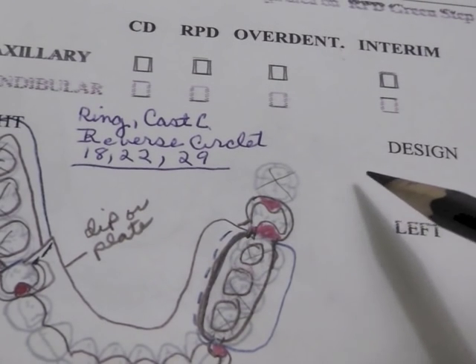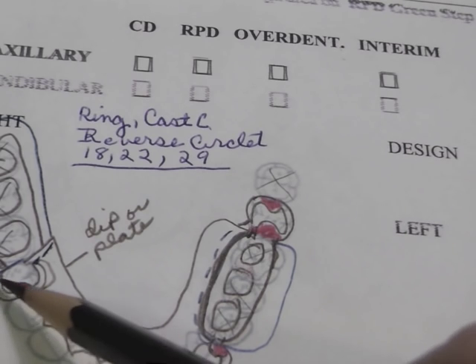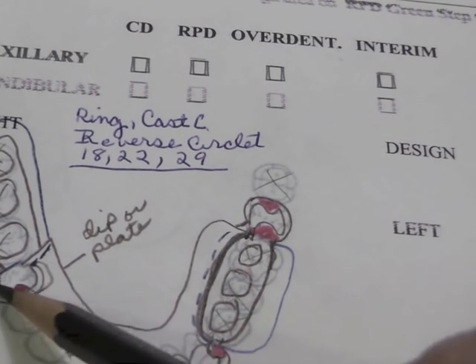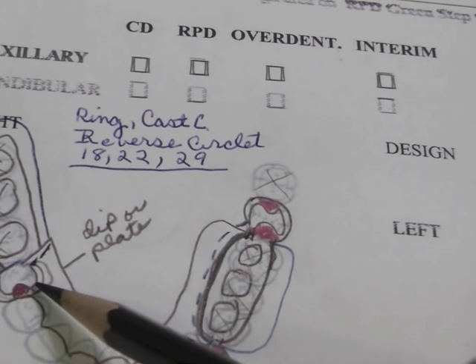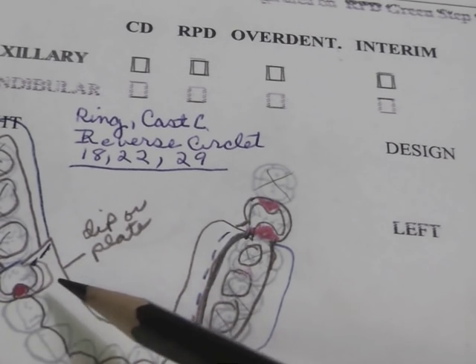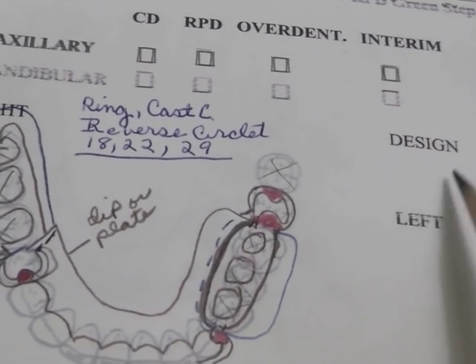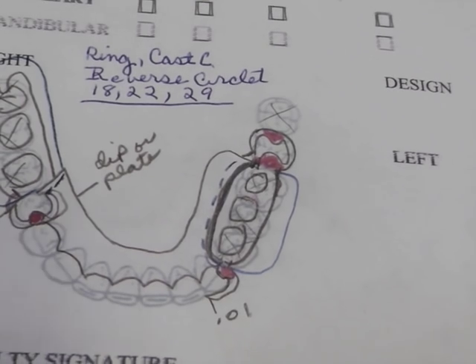Here's another option. We've used the interproximal ring clasp — or the reverse circlet clasp, as it's called in two different textbooks — which calls for a distal facial .01 undercut, a cast direct retainer, a mesial rest, and a lingual arm on the lingual side, or a plate if you don't have enough room to dip down. This one also shows the cast circumferential clasp — that's really the only difference there.